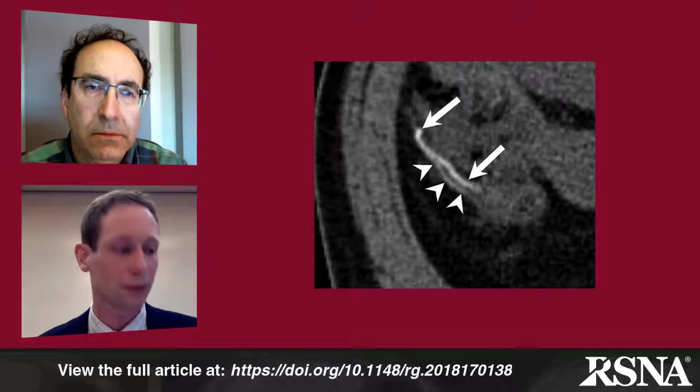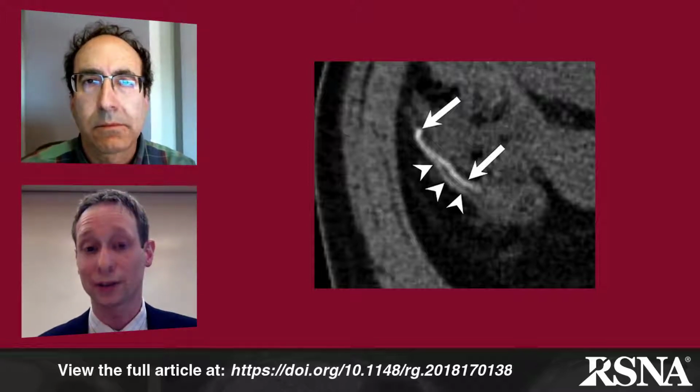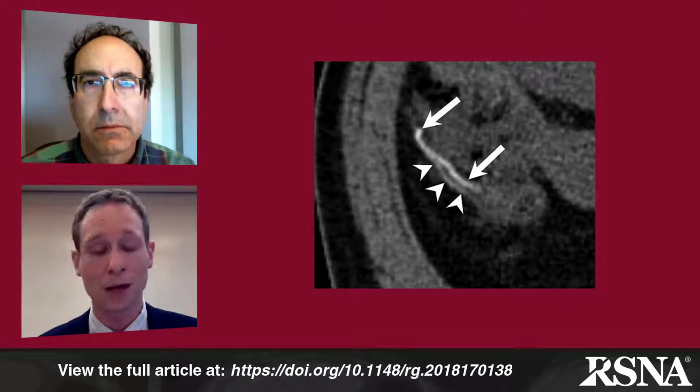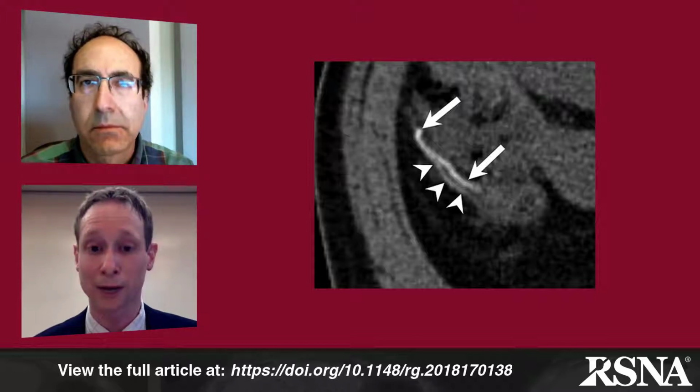A lesion that could look similar to this would be a Dieulafoy lesion. Oftentimes we don't see anything other than active extravasation with those. When we do see them, again, we'll see a feeding artery with a central nidus of enhancement. But in that case, there's a capillary network present. We do not see these early draining veins.